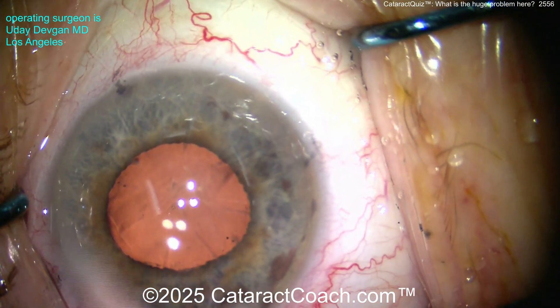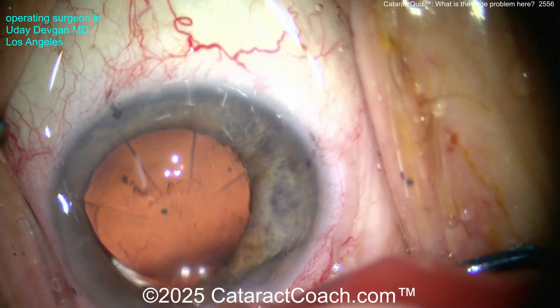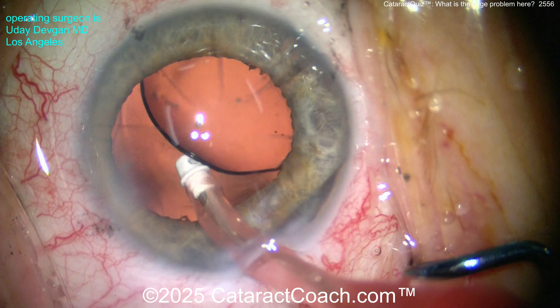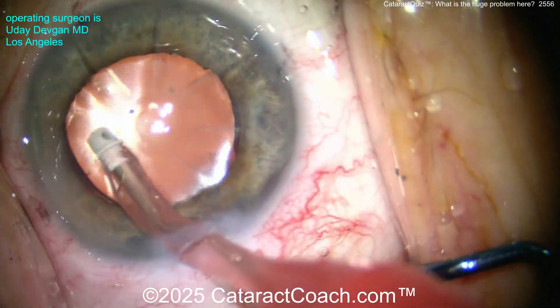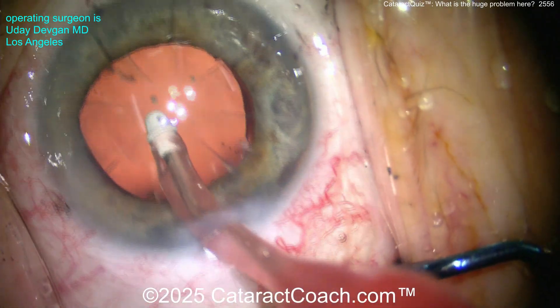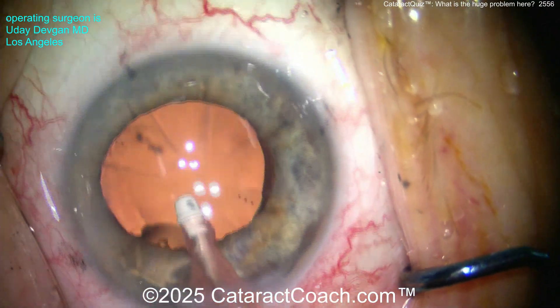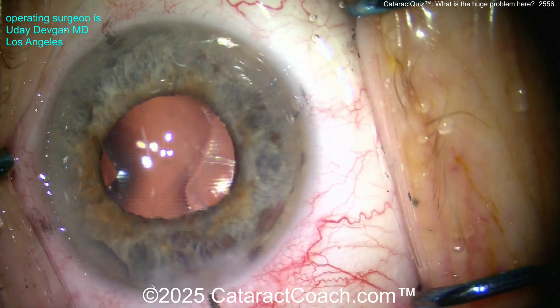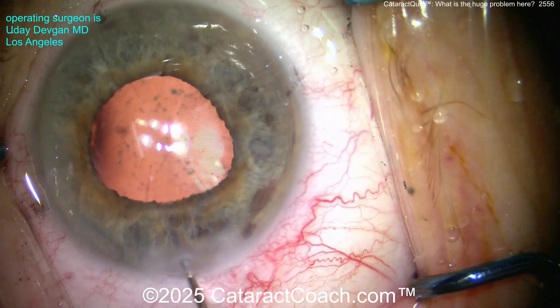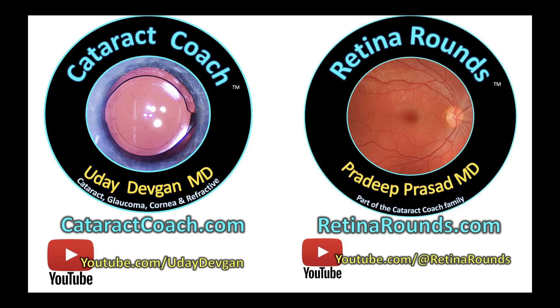Obviously the patient has a smaller pupil. This is why I always like to check — in a case with maybe four and a half to five millimeter dilation, you can do the whole cataract surgery beautifully, but at the end when the eye is full of viscoelastic and the lens is in the bag, lift up the iris 360 degrees. Make sure the lens is totally in the bag, and also make sure there's no residual lens material — a little bit of cortex, or in this case a humongous chunk of nucleus. The rest of the case goes routinely. I also like to use fluorescein dye to check all the RK cuts to make sure they're fine. Beautiful case — glad you enjoyed the cataract quiz. Check out Retina Rounds, our new sister channel!